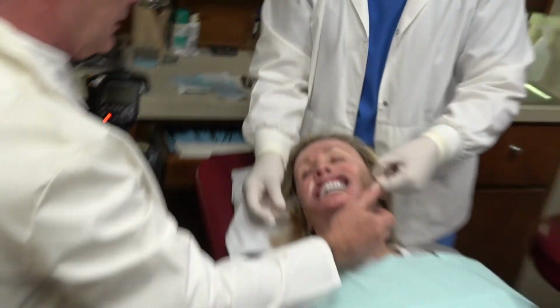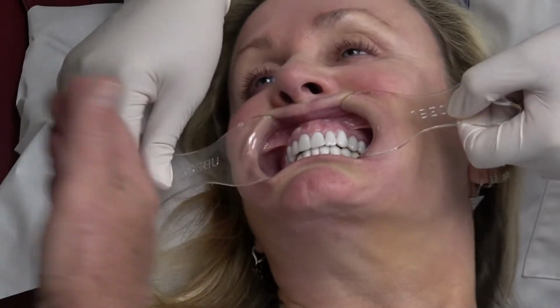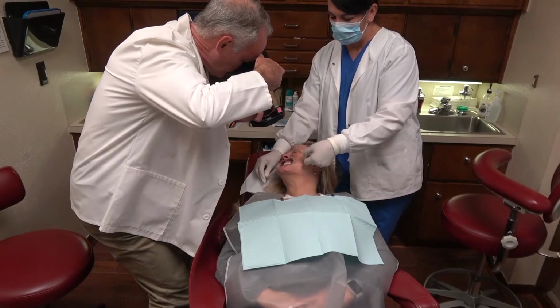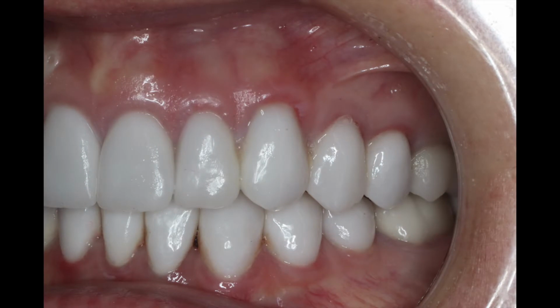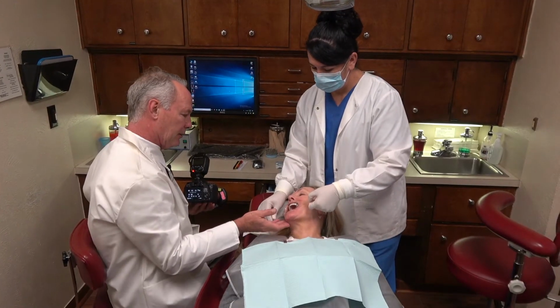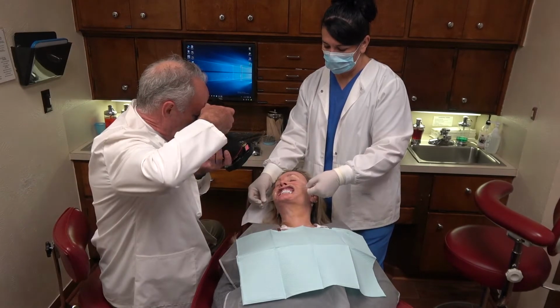Now bite down again and turn my way, please. Turn my way a little bit more. That way, just there. And this shows a fracture, exposed crown margins, gum line decay. Now turn that way just a little bit. Bite down all the way. These are two lateral views.